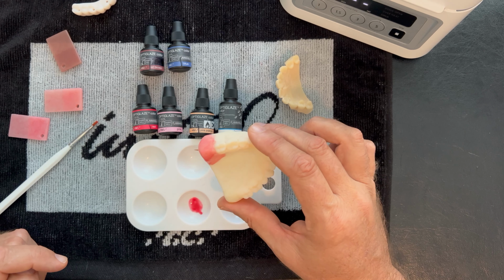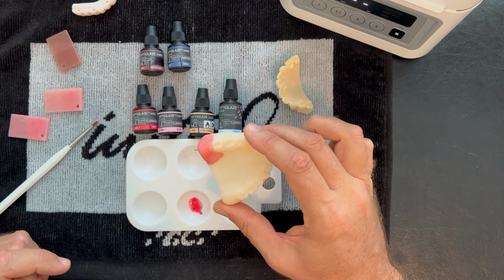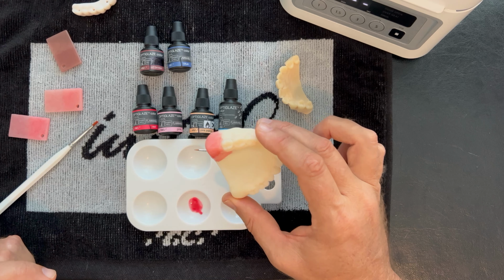So that's a quick and easy way to colorize the pink tissue areas for your print materials or mill PMMA. If you have any other questions, give your local GC rep a call.